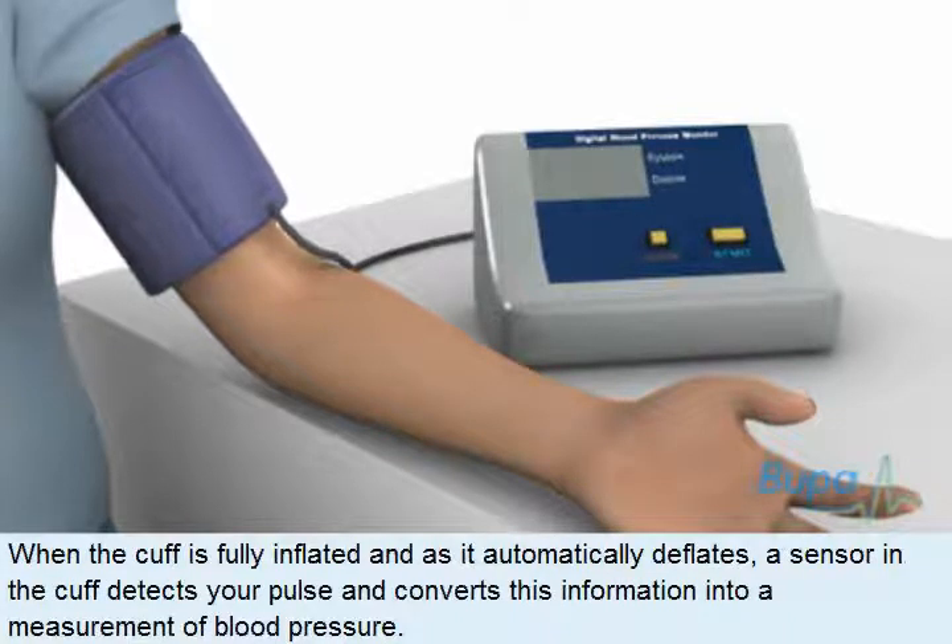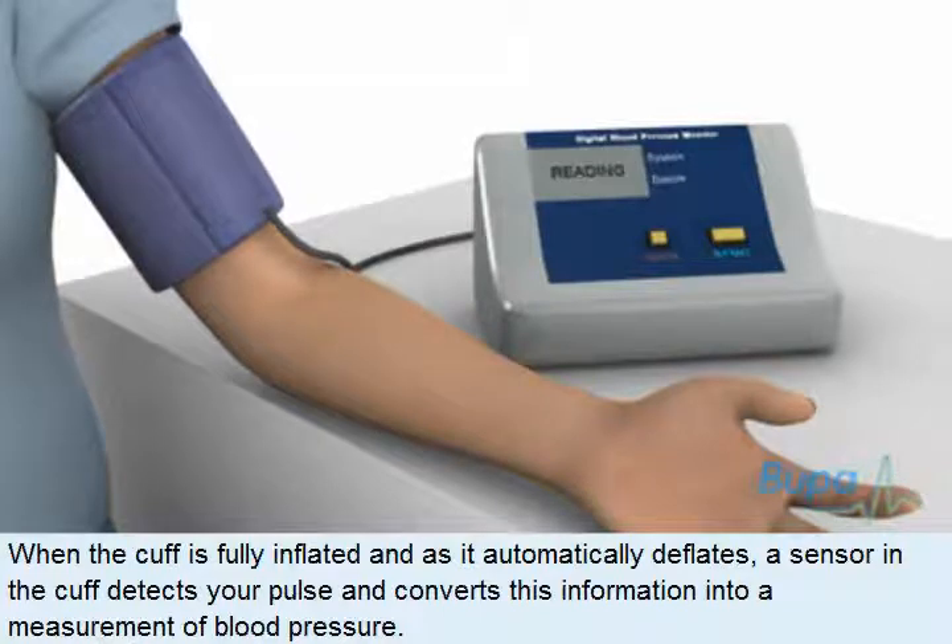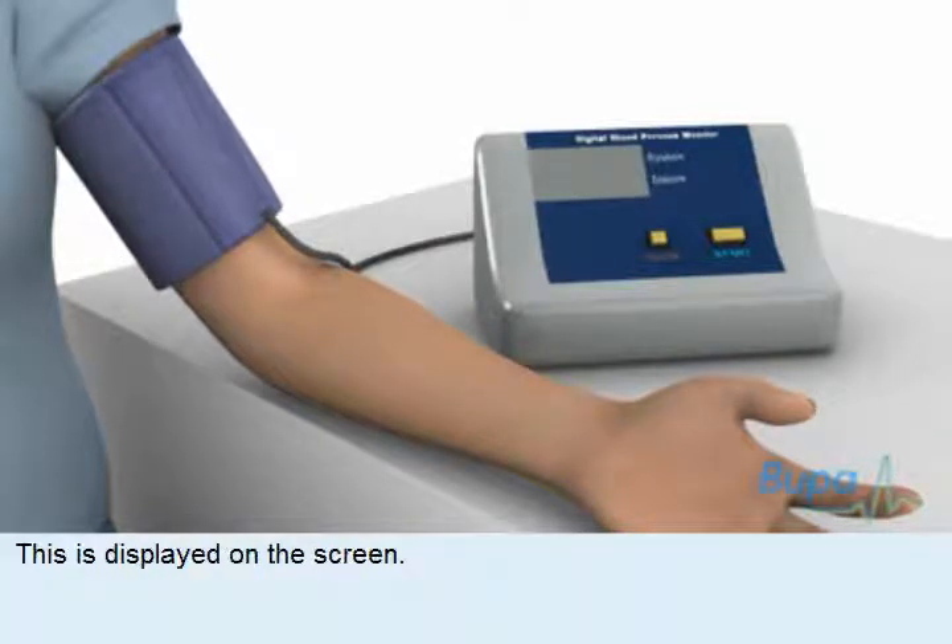When the cuff is fully inflated and as it automatically deflates, a sensor in the cuff detects your pulse and converts this information into a measurement of blood pressure. This is displayed on the screen.